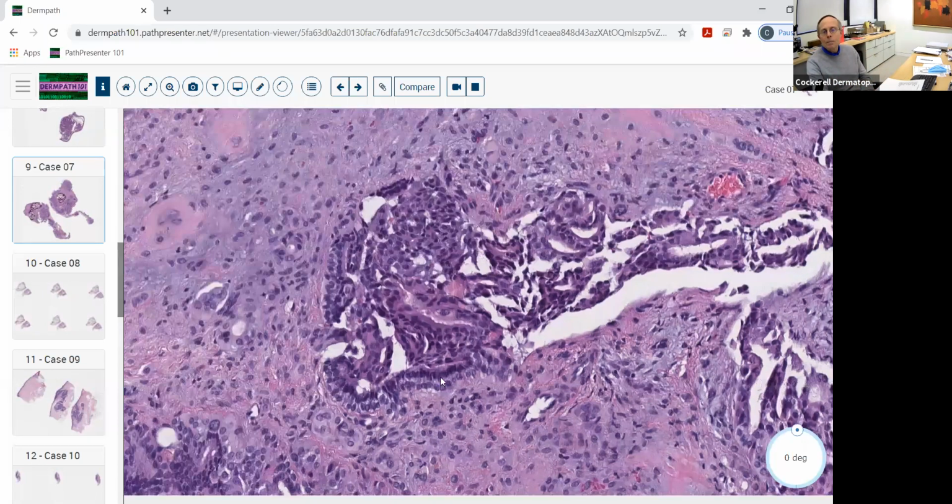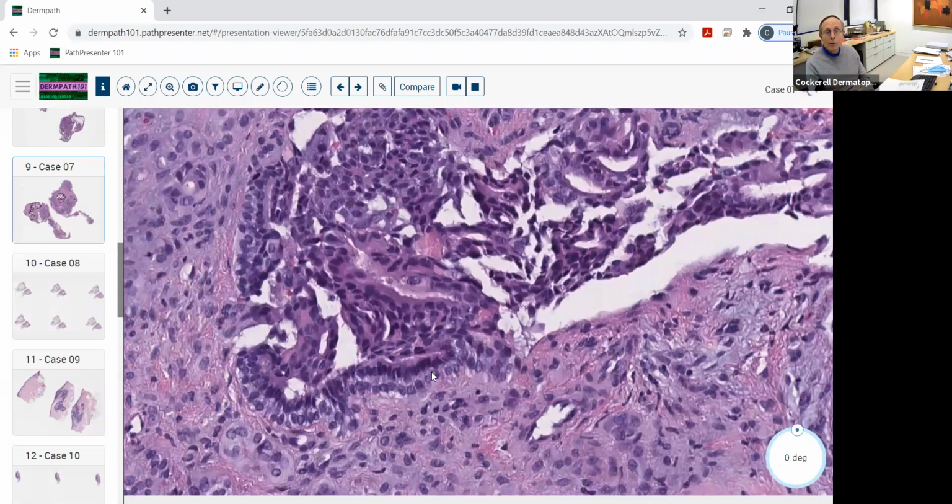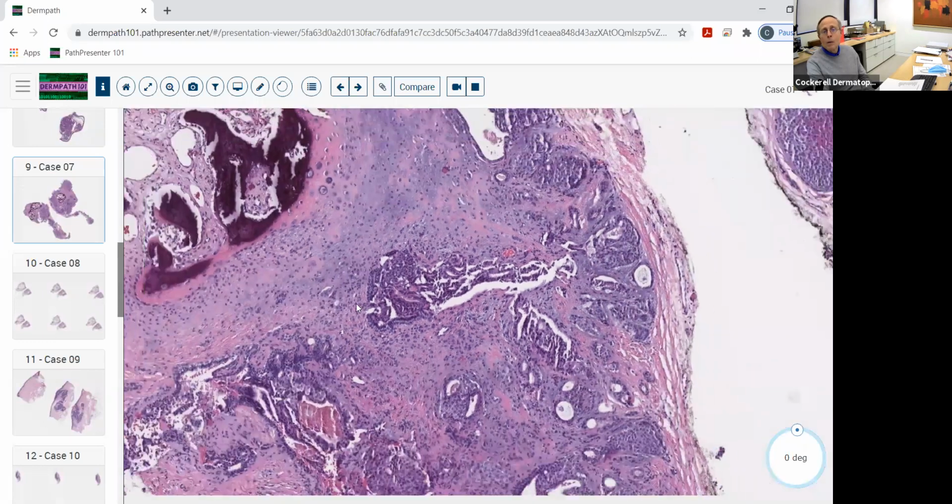And when you look at those lesions, they can have apocrine morphology to them as well. You actually have myoepithelial cells there. You can stain that with a smooth muscle actin and highlight the myoepithelial cells. And in some of those cases, you can get a prominent proliferation where the majority of the cells are comprised of the epithelial component with relatively little mucinous component or relatively little cartilaginous differentiation in the lesion. Then those end up getting called monomorphic adenomas, but they're basically the salivary gland analog of what we see in a skin mixed tumor. So just be aware of that.